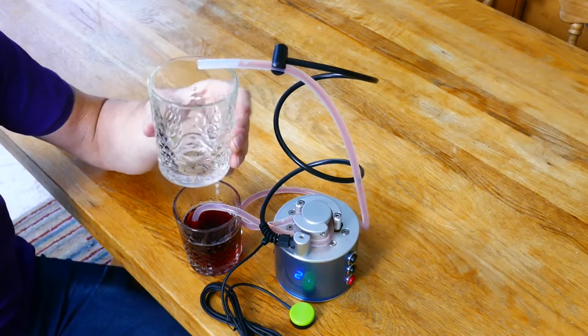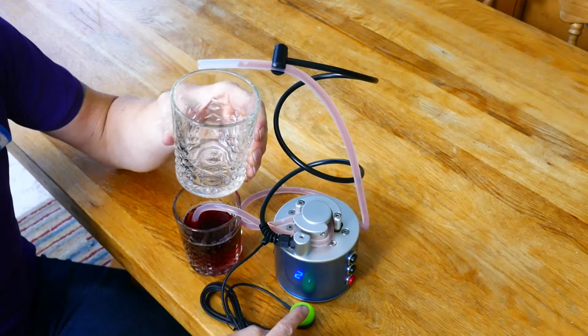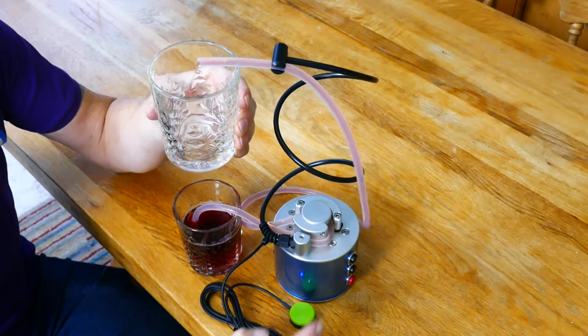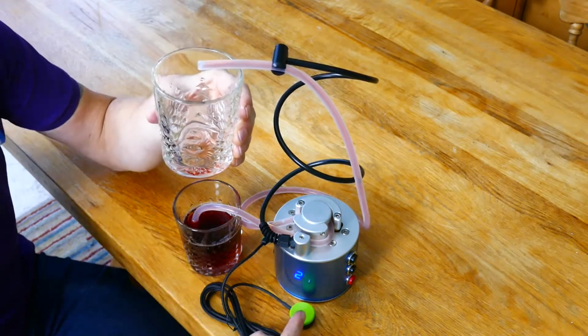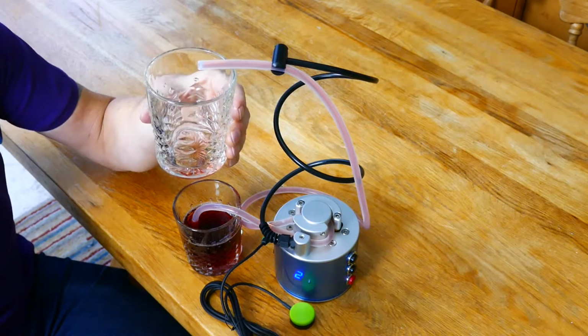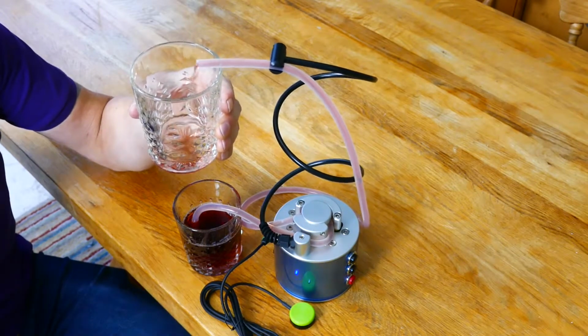I'm going to hold a cup underneath so you can see the drink coming out. So to actually use the drinker, you put the straw in your mouth, you press and hold the button, and you'll see a small amount of drink comes out. What you'll notice, I'll do that again, is that if I click the button, it doesn't pump. You actually have to hold the button for it to pump, so you don't accidentally pump.